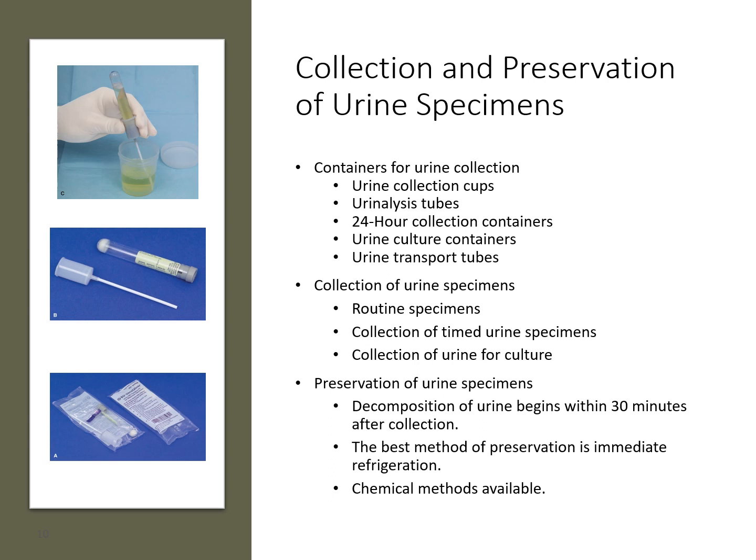So with some urines, the decomposition of things in the urine can begin within about 30 minutes. So making sure that it's timely processed, or that preservatives are added based on what you're looking for. So there are some chemicals that are added to that urine container that helps to keep that preservation intact. And another alternative to preservation would be refrigeration, to keep any of those elements from breaking down, which could give false results.